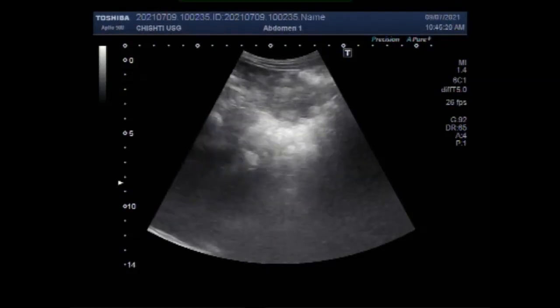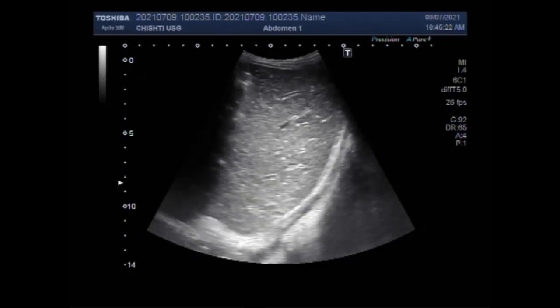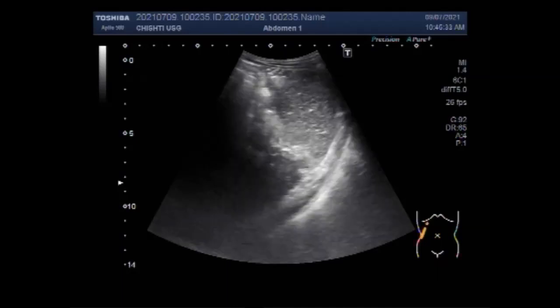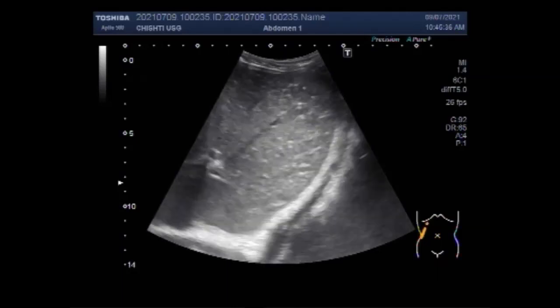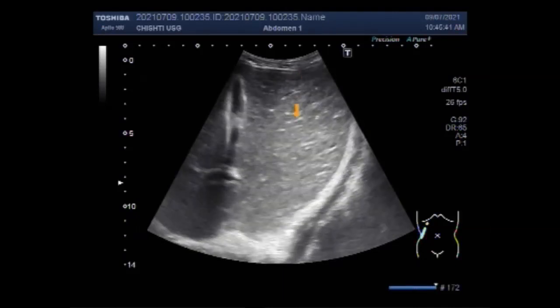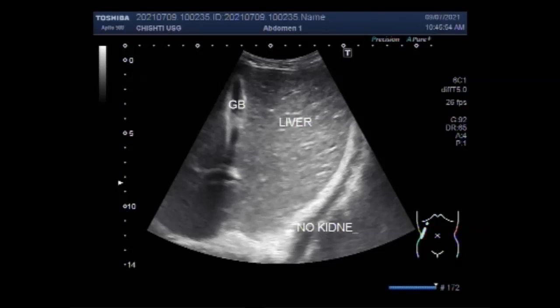Dear viewers, I hope you are all fine. This ultrasound video shows a diverticulum of the urinary bladder. The patient has a single kidney — the right kidney is missing and the left kidney shows hypertrophy. The patient is aged about 11 to 12 years, male. You can see the right kidney is not visible in its normal anatomical place.